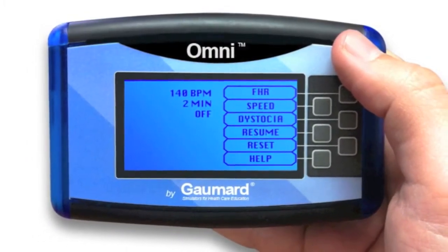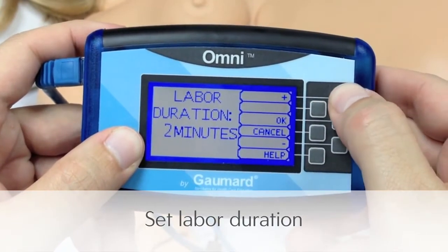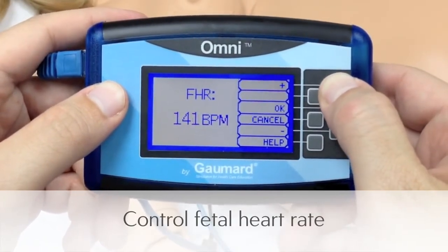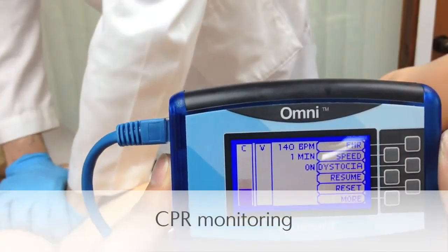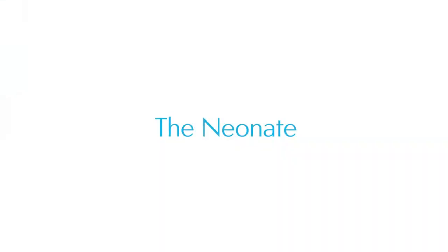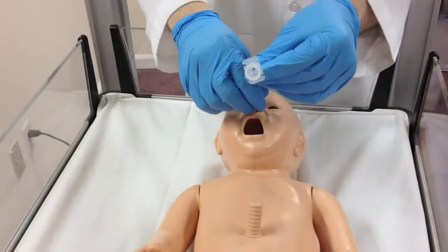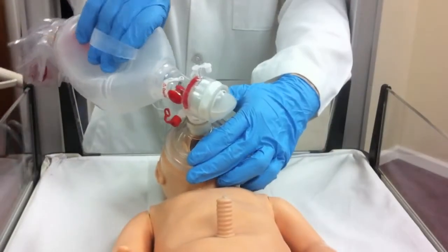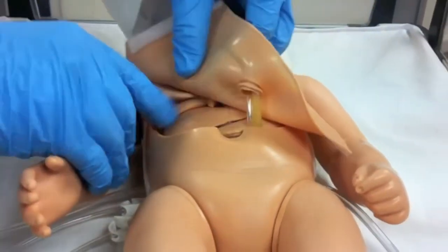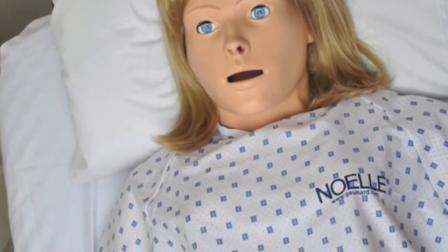NOEL is operated by the Omnicontroller, which manages both delivery and CPR monitoring functions. The neonate can be intubated orally or nasally. Students can perform CPR and provide medications through the umbilical cord. The upper torso contains the heart, lungs, and ribcage, providing anatomical landmarks.